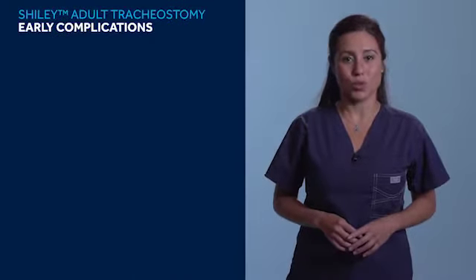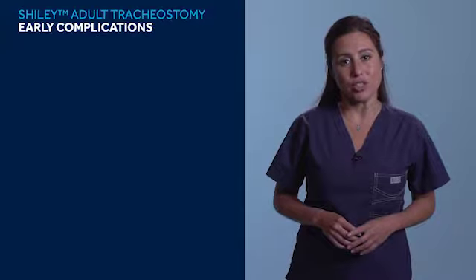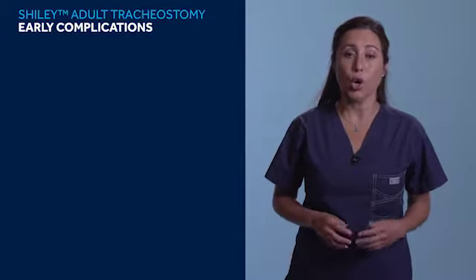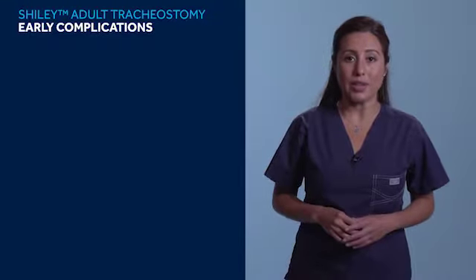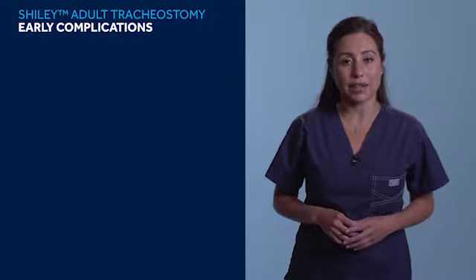As with any surgical procedure, there may be complications related to the procedure itself or to the patient's underlying disease. It is a clinical priority to understand and prevent early and late complications.